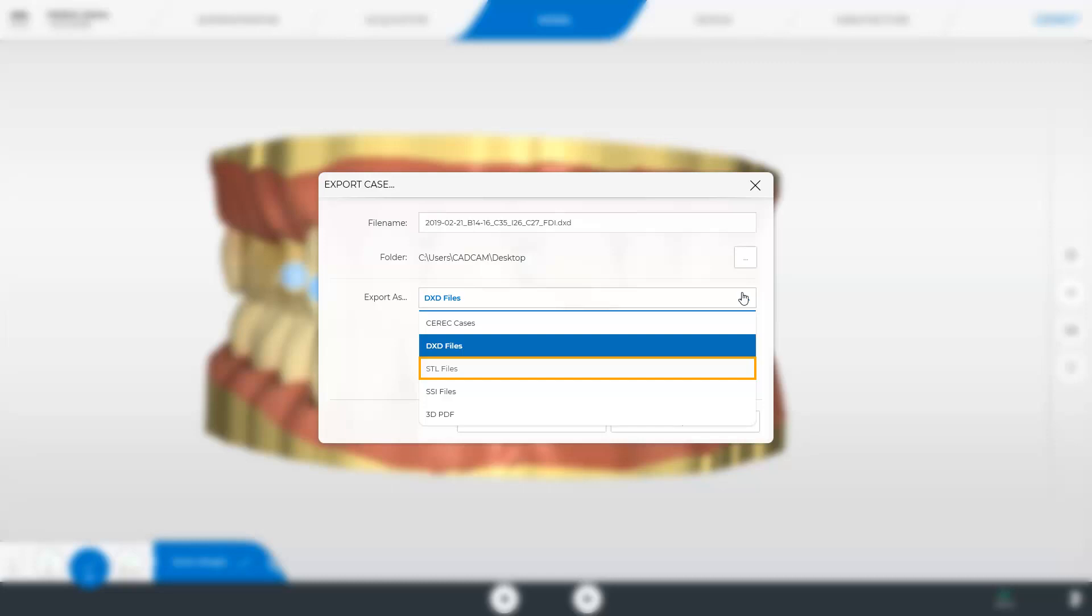There are three resolutions to choose from: highest, medium, and reduced. Not every receiving software can process all data volumes. The resolution must be selected depending on the program with which the data will be further processed.